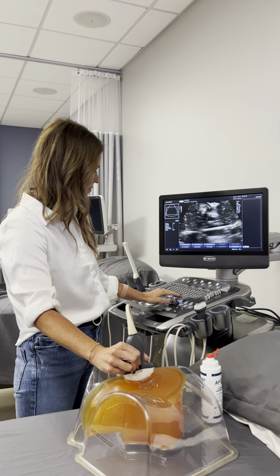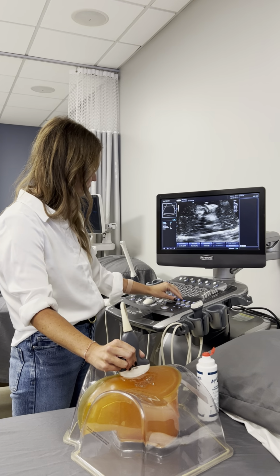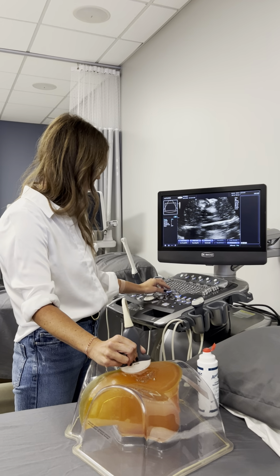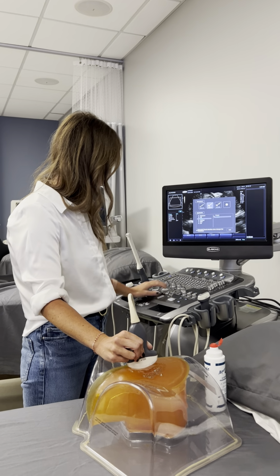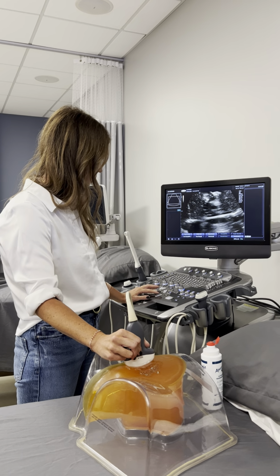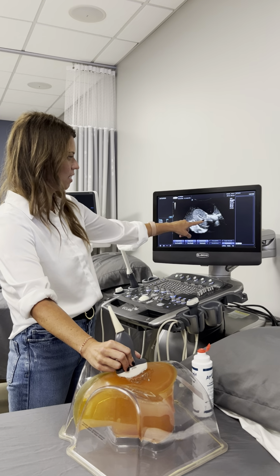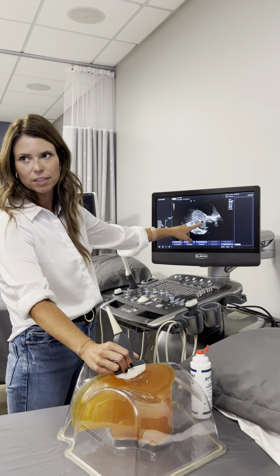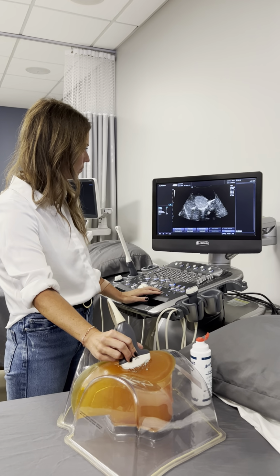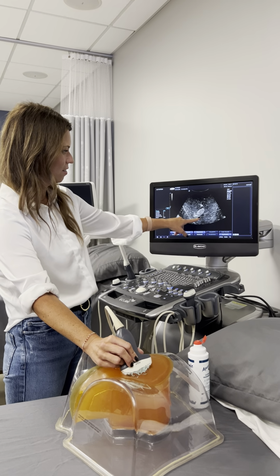Then I'll put color on if she was a real person. Let me go here. I like this setting better. You can see that she has a little bit of fluid in her endometrium, so she might be going into her period. Then I'm going to come over to the left and look at her ovary over here.